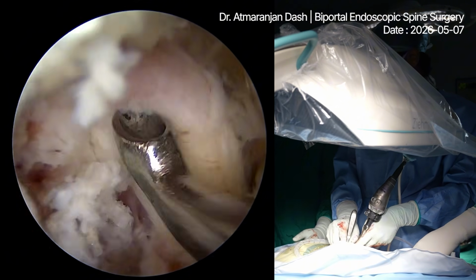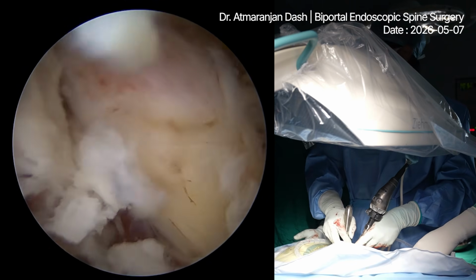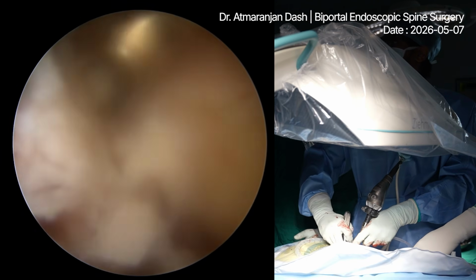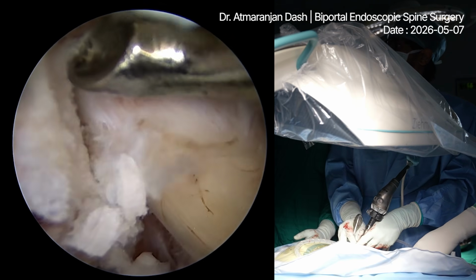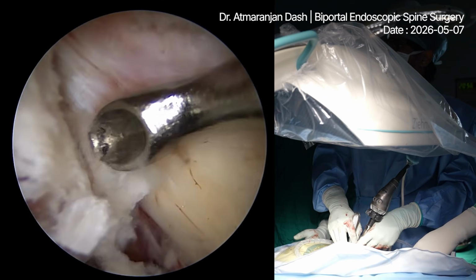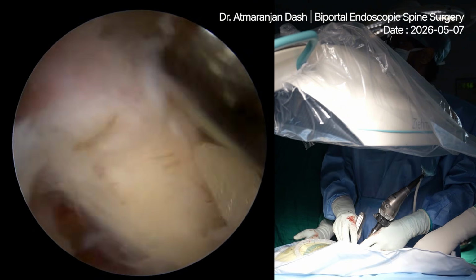You see. This work is very important. Okay. Yes, sir. So now you get a little relaxed root.